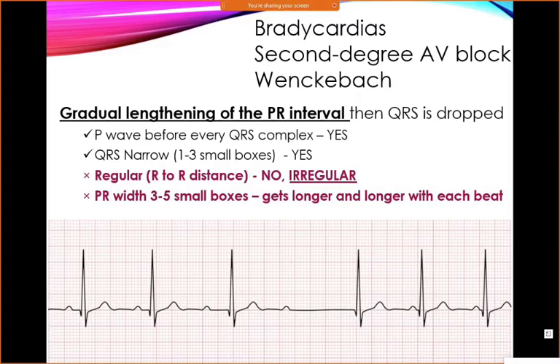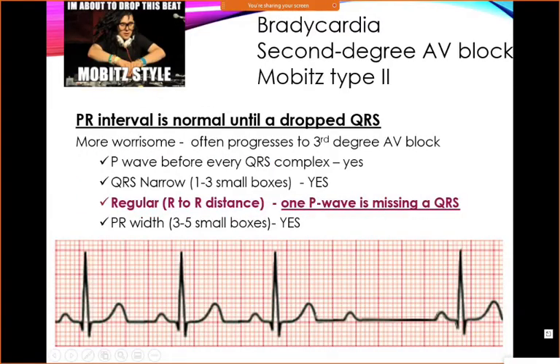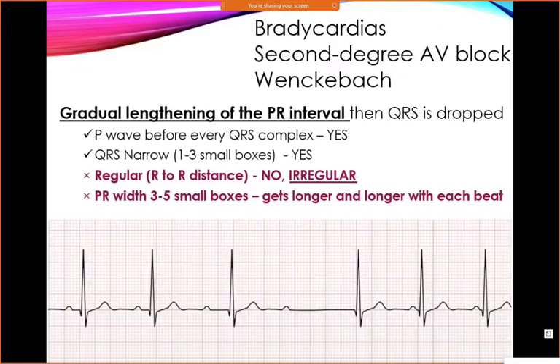So when we look at this one, first of all, we always have to look at the rate first. One, two, three, four, five, six. So our rate is 60 here. Right now we're thinking, okay, that's starting to get to be a bradycardic one.